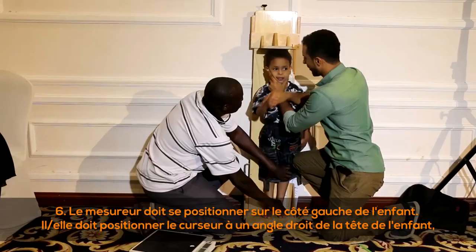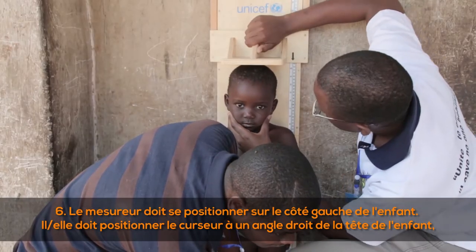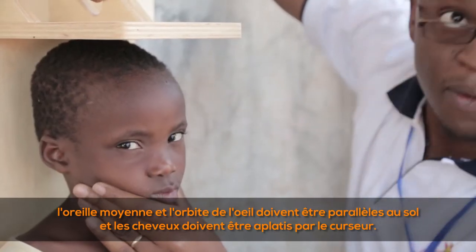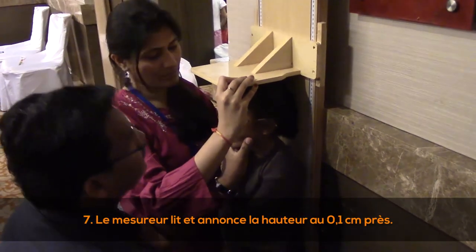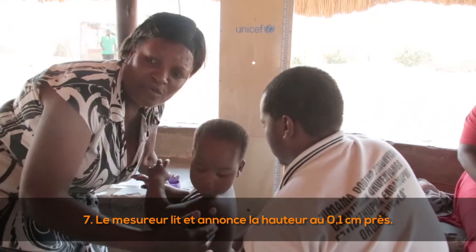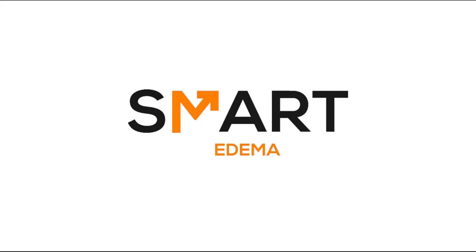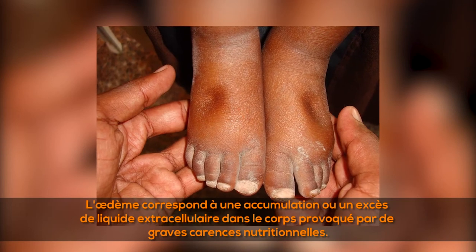(6) The measurer, positioned on the left-hand side, positions the head and the cursor at right angles — the middle ear and eye socket should be parallel to the ground and hair should be compressed by the cursor. (7) The measurer reads and announces the height to the nearest 0.1 centimeters. The assistant repeats the measurement out loud and records it.